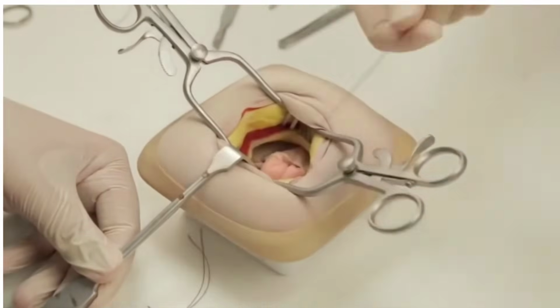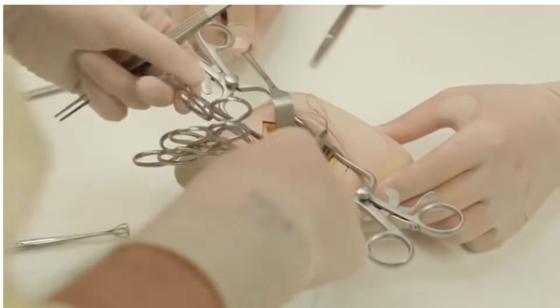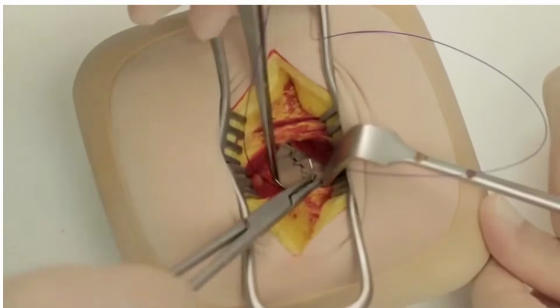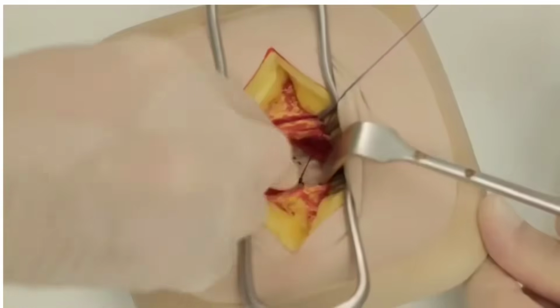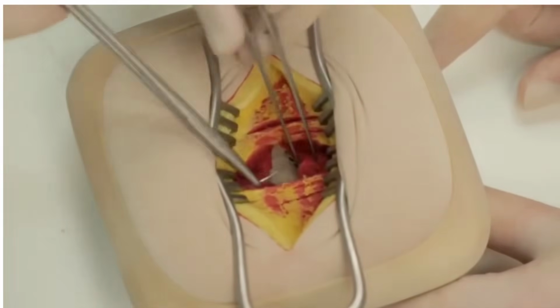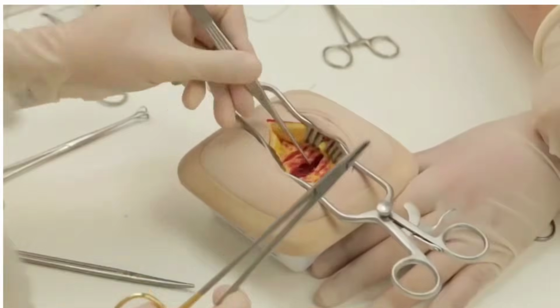Close the muscle layers by approximating the internal oblique and transversus with absorbable sutures if they were split widely. Reapproximate the external oblique with continuous absorbable sutures. Close subcutaneous tissue as needed.